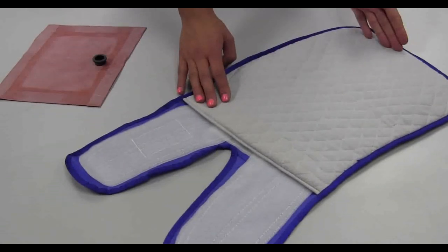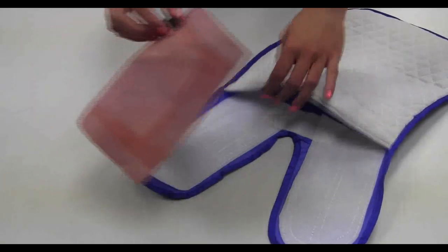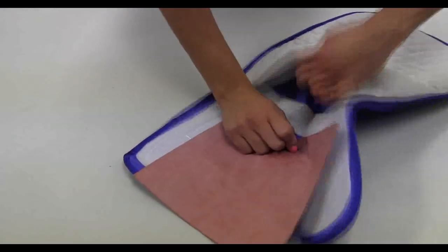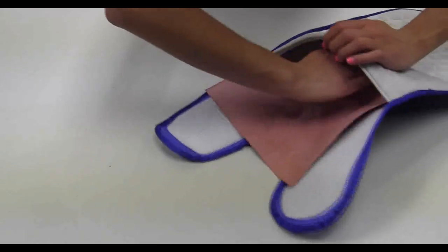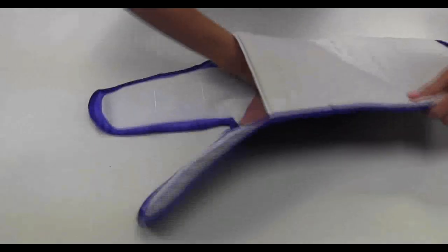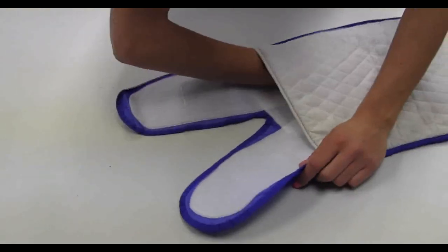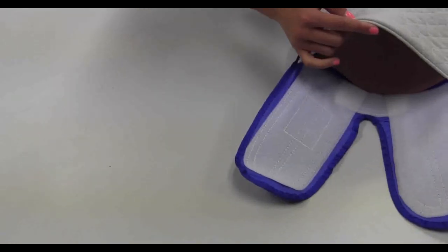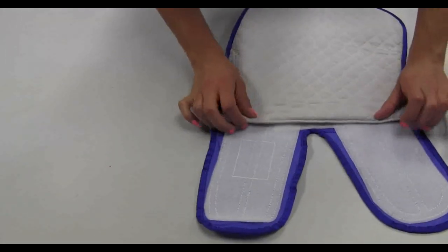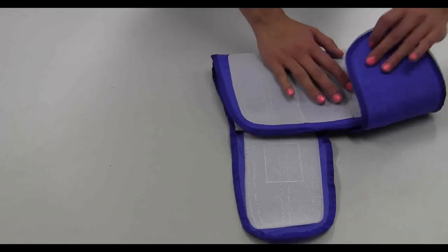Turn over the calf cuff, exposing the calf cuff lining. Open the hook and loop binding. Insert the calf cuff bladder inlet first — be sure the inlet is inserted first. Push the bladder inlet through the cuff inlet opening. Fold out the bladder, smoothing out all wrinkles and creases. Make sure the bladder faces the calf cuff opening. Close the hook and loop binding. The calf cuff is assembled.